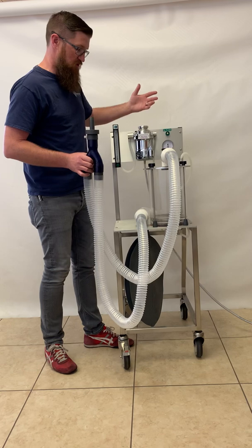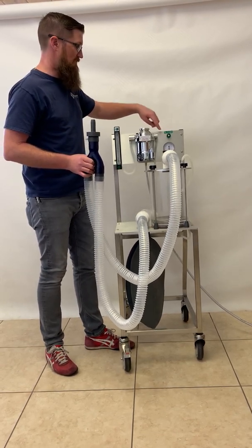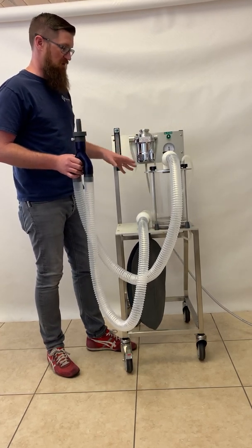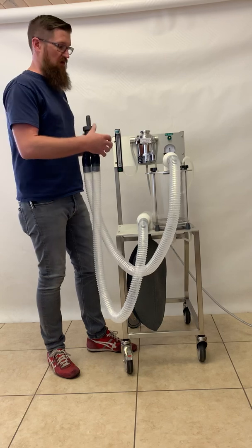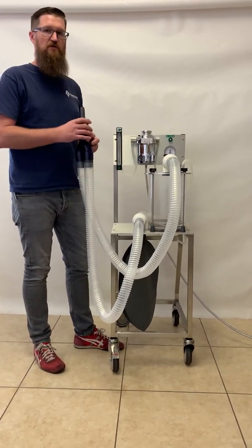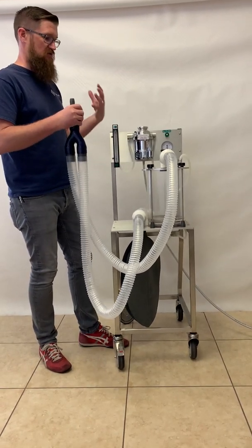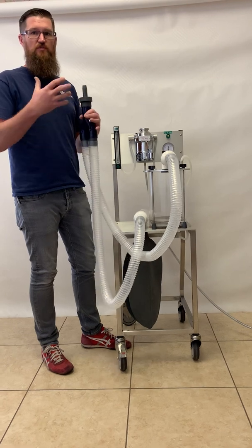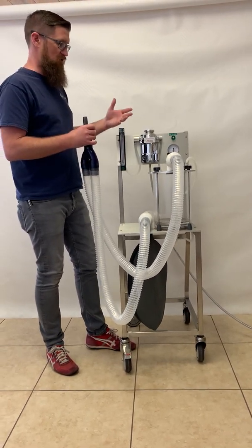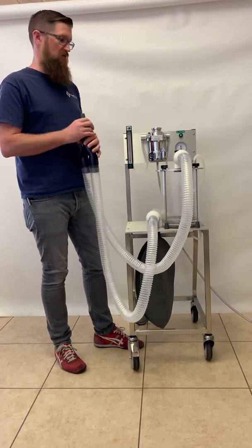The only other major component of the system is the flush. The flush valve bypasses the vaporizer and puts out pure oxygen into the system to either flush the system or to add more oxygen if the patient needs more. If there's too much anesthetic gas and the patient is too deep, hitting the flush will add a blast of pure oxygen into the system to dilute the mixture.